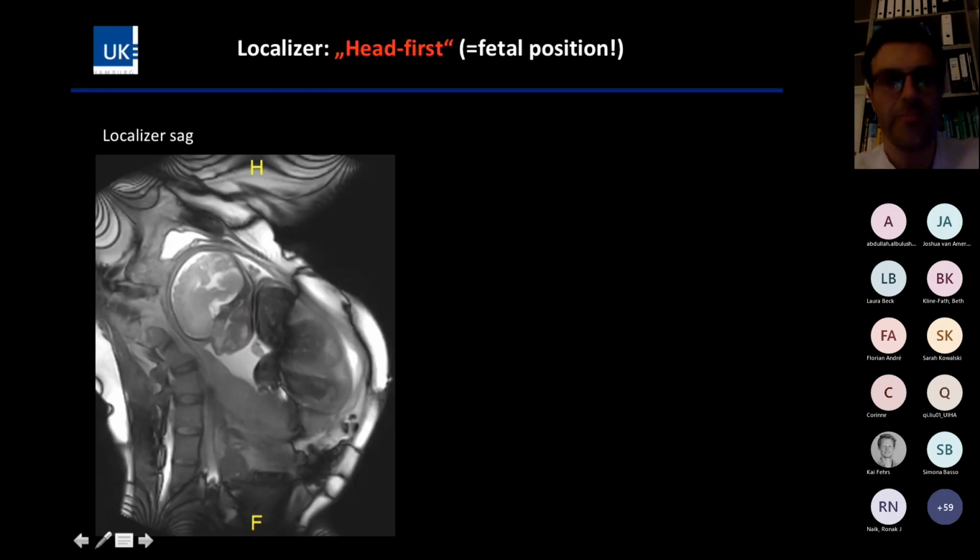Yes, hello from Hamburg to all over the world. I'm happy to give you a short overview, because we're limited on time, of how we perform fetal CMR in our institution. So the first thing that I would like to announce is that it's quite comfortable if you choose on the patient settings, that's a localizer.